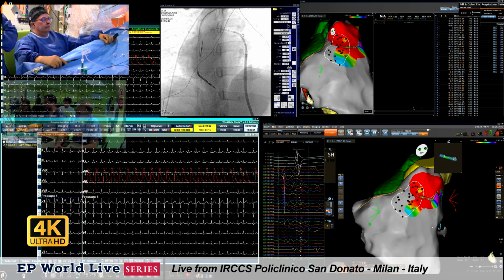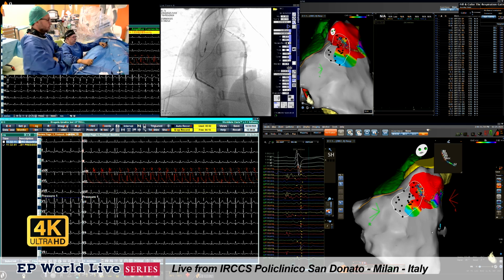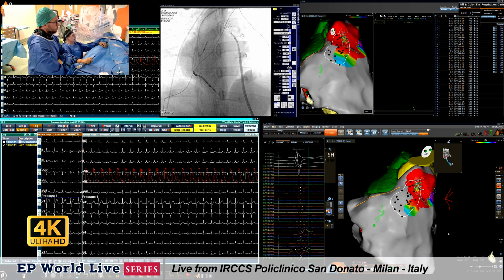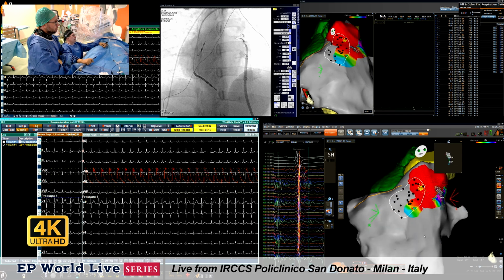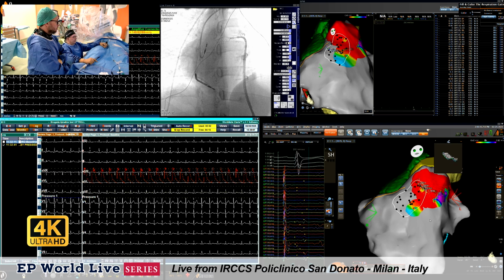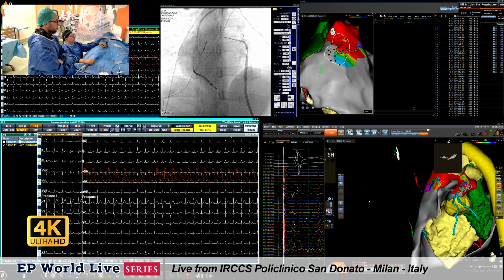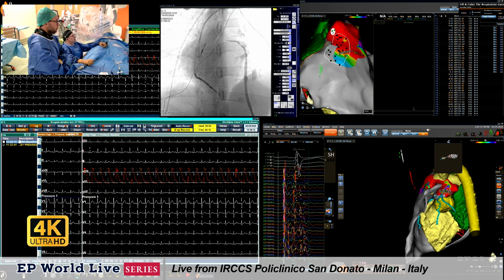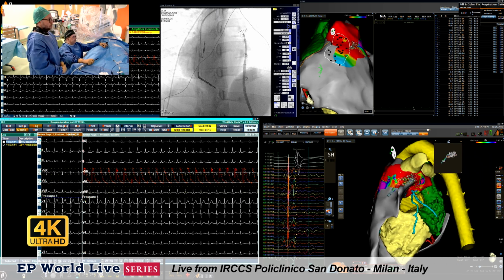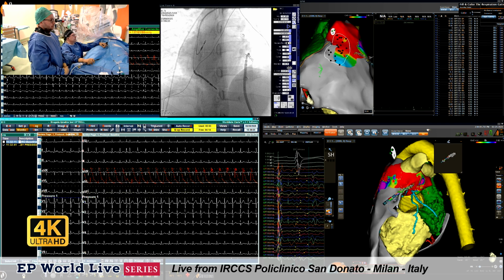So we are in the middle of the area. Actually, far away now. We are posterior oriented. Now we need to move anterior. That's left.